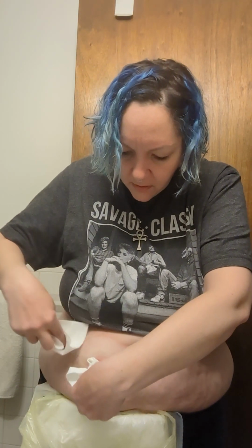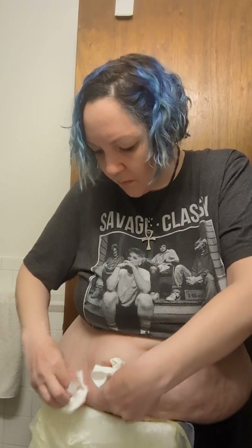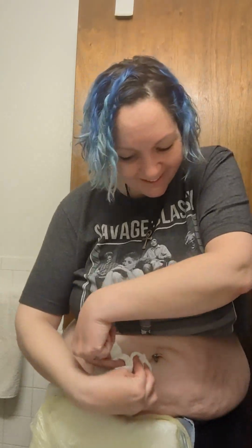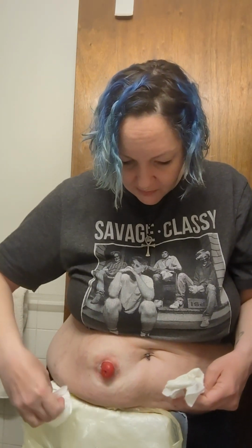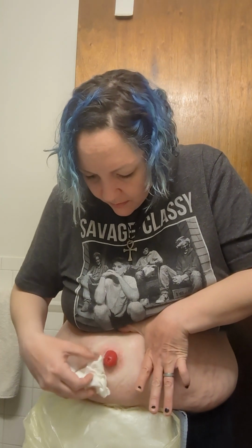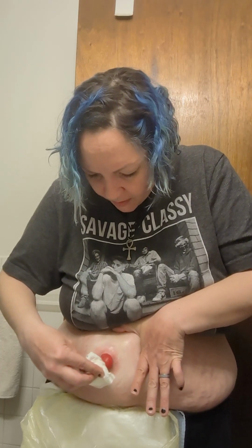Originally I used gauze for all of this, and right now Viva paper towels. I've made so many things work. If you told me when I was going in for my operation that I would even do this video, I'd be like, shut the front door, not happening. Alright, I'm just getting the powder off the bag. It's off my skin. You're looking beautiful today, Miss Moira.